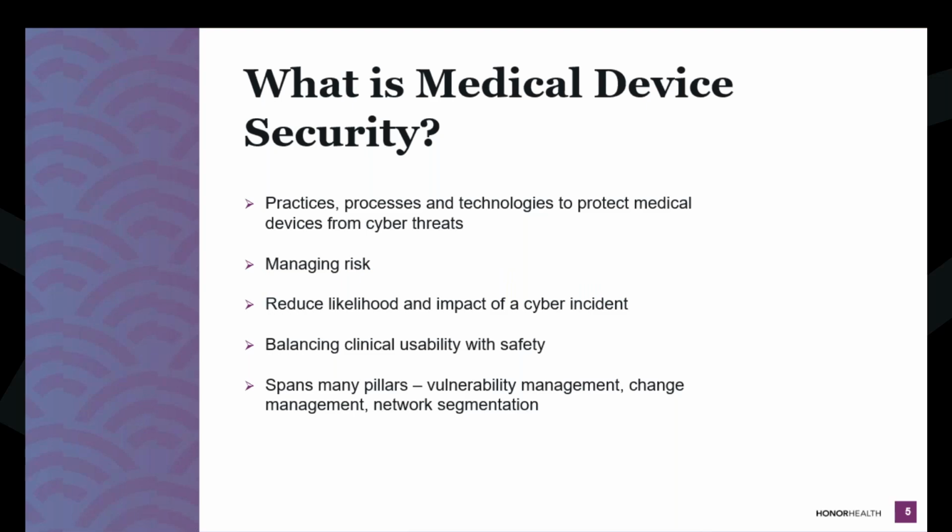You're going to have to identify where all your tentacles are. What does your equipment talk to? Does it talk to your EMR, your PACS? Does it talk outside? What kind of communication? Does it talk to the internet, or does it just talk internally? And does it talk to other peer devices next to it, printers, workstations? The devices are getting more and more connected.